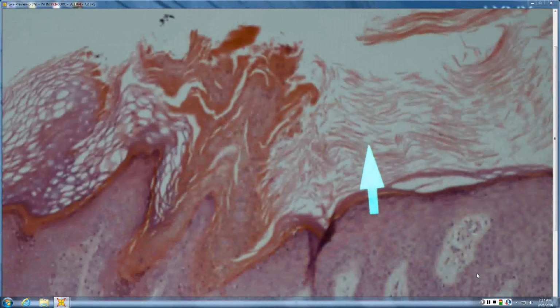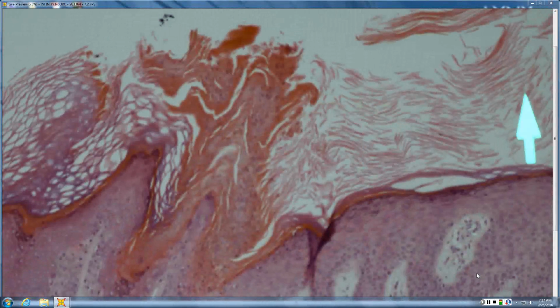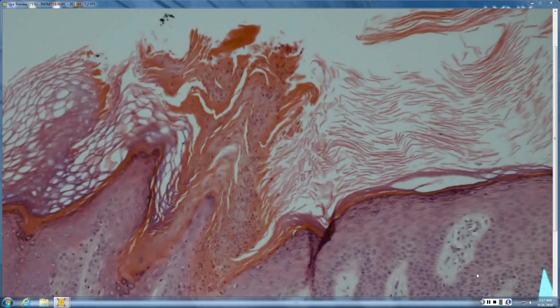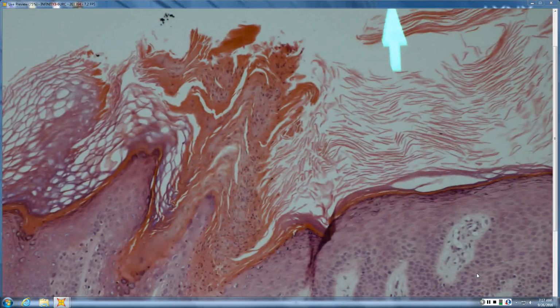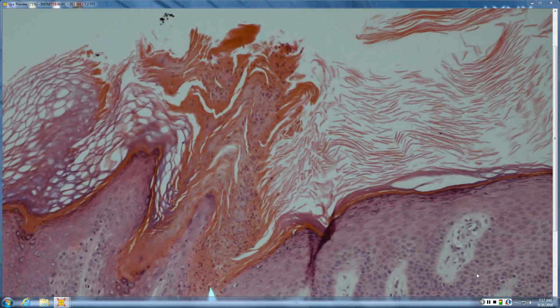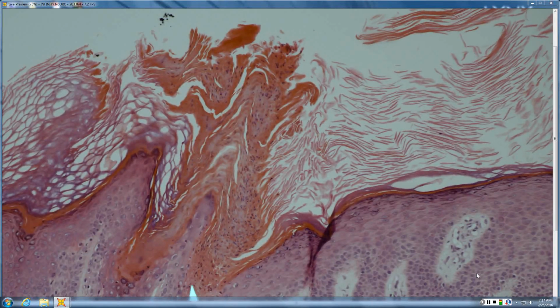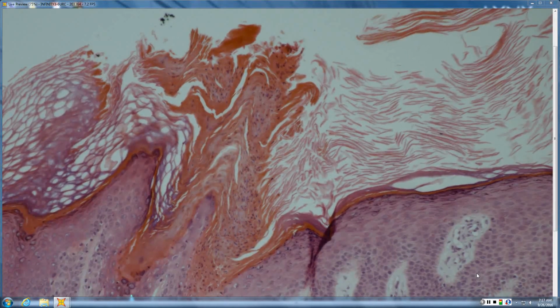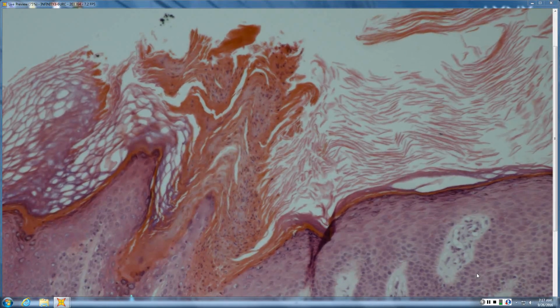And so anything goes inside of porokeratosis. It can be lichenoid, it can be atrophic, it can be psoriasiform. But this column of parakeratosis with not only diminished and loss of the granular layer, but also some dyskeratotic cells, so almost maybe forming corps ronds and grains and that type of stuff. That goes with the cornoid lamella and porokeratosis.